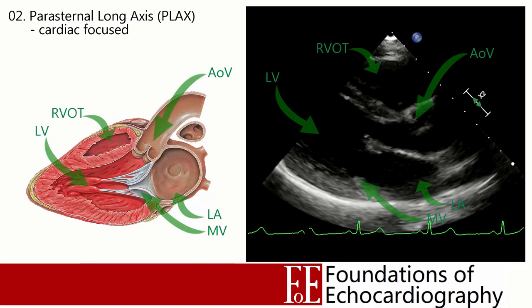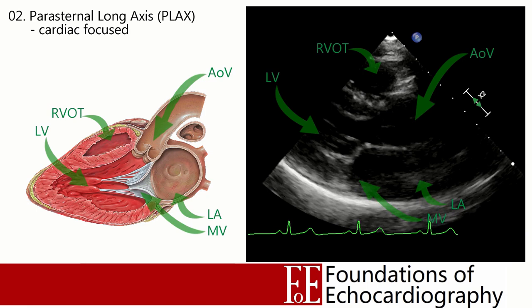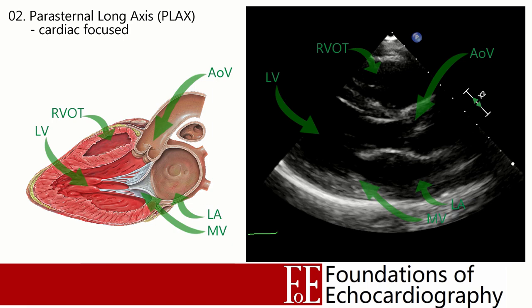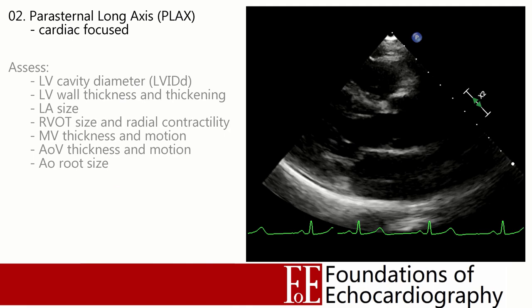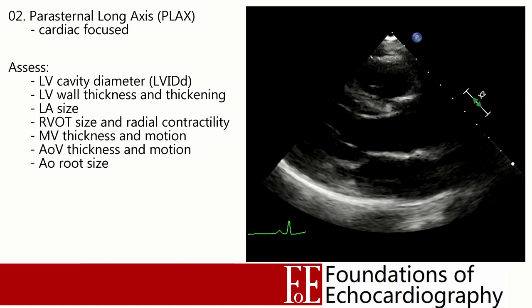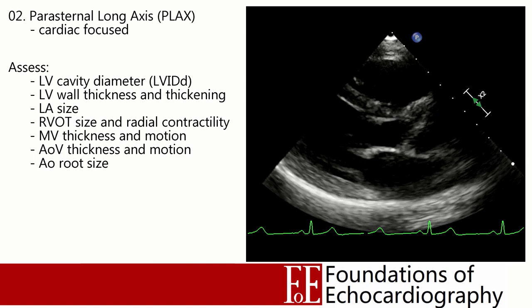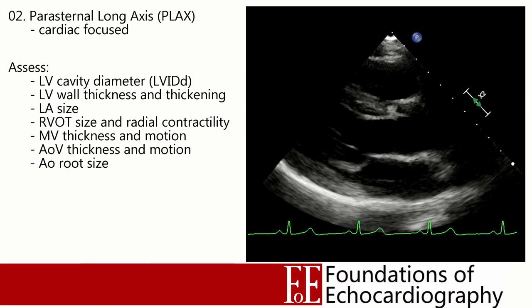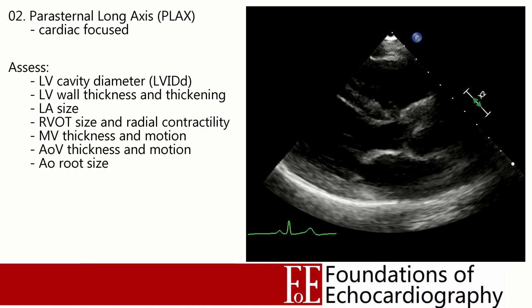In the parasternal long axis cardiac-focused view, we have the left atrium in the bottom right-hand corner, which opens through the mitral valve into the left ventricle. Sitting directly anterior to the mitral valve is the aortic valve, opening into the aortic root and proximal aorta. The most anterior cardiac structure visible is the right ventricular outflow tract. We need to assess the LV cavity size — specifically the internal diameter at end diastole — look at LV wall thickening during systole, inspect the aortic and mitral valves for leaflet thickness, adequate opening, and whether they close and meet in the middle without prolapsing back.